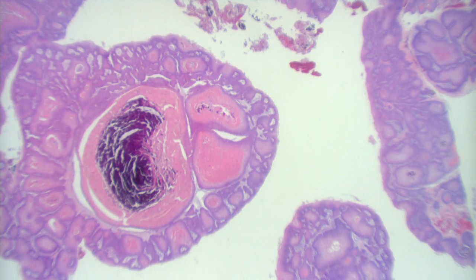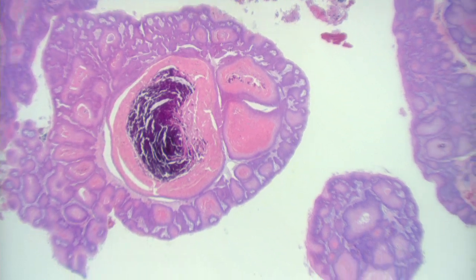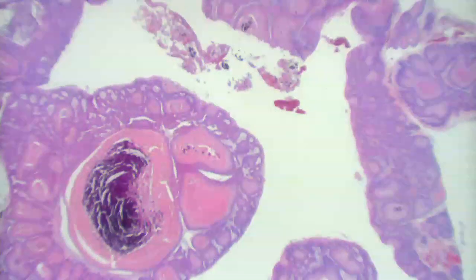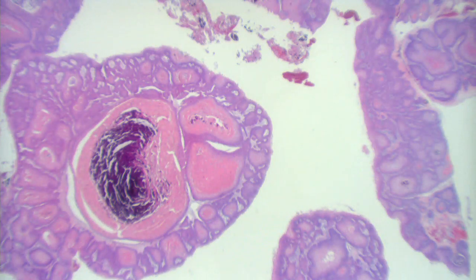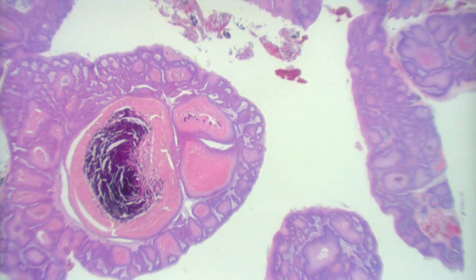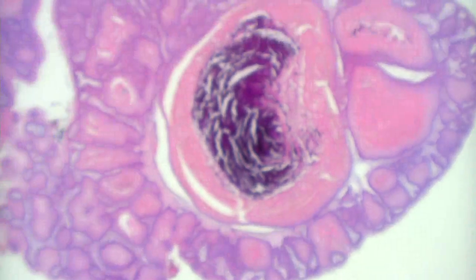So here's the excision, kind of large. Or maybe, like we had before, another one of these enucleations. Good. Can we see this large tumor made up of nodules of varying sizes? Epithelial or non-epithelial? Epithelial. Good. Benign or malignant? Benign. Good. You see this large dystrophic calcification in the center of it.